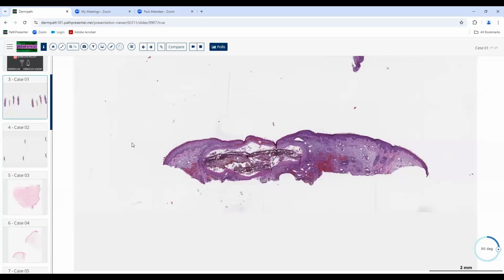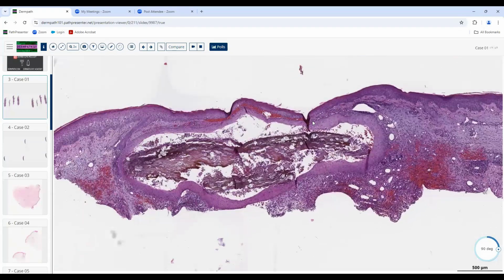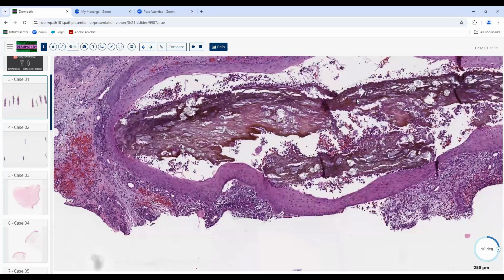It's on severely sun-damaged skin. It's not on the face. It's probably maybe the extremity, most likely, given this diagnosis. And you see there's something that's abnormal right here. When you're faced with something that looks like it clearly doesn't belong in the skin at all, then you're dealing with things like foreign material, possibly, or maybe infectious diseases. So you want to keep your mind sort of broad and think about different things that can do this. And here you see it's got this brown color to it.